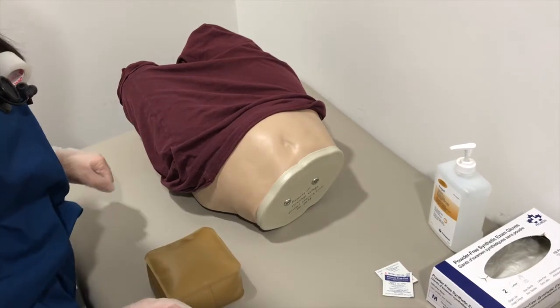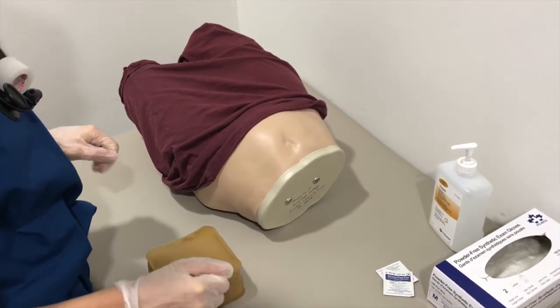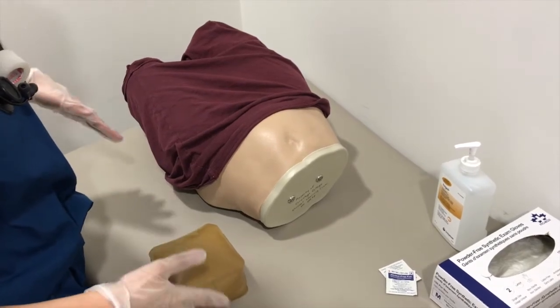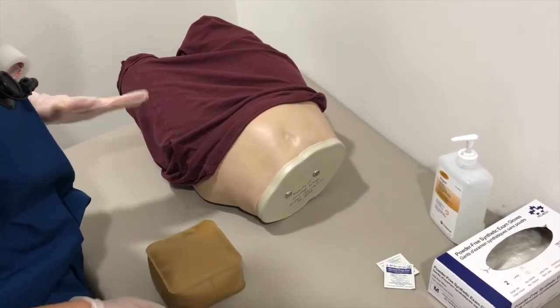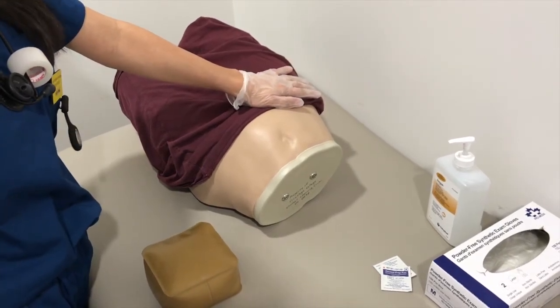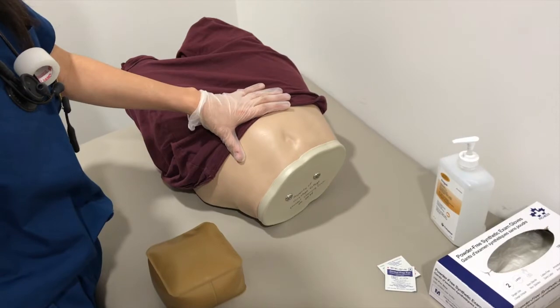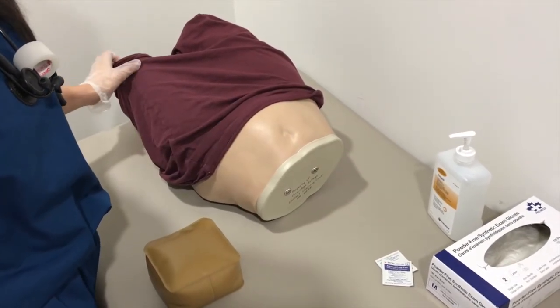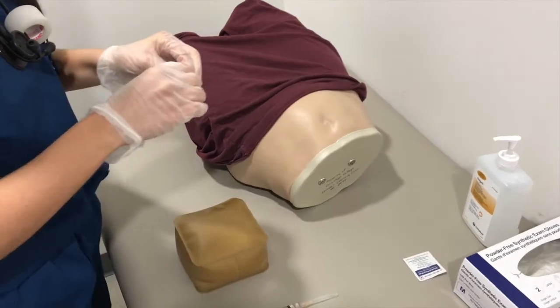And when you're giving the subcutaneous injection, it's important that you do it at a 45 to 90 degree angle, depending on the patient's muscle mass, body build, etc. So for our patient, we can see that they, again, as I explained before, are an appropriate weight and are pretty lean for their age and gender.